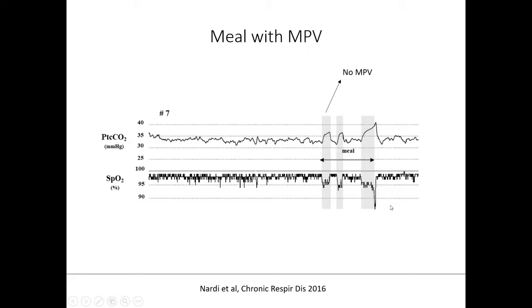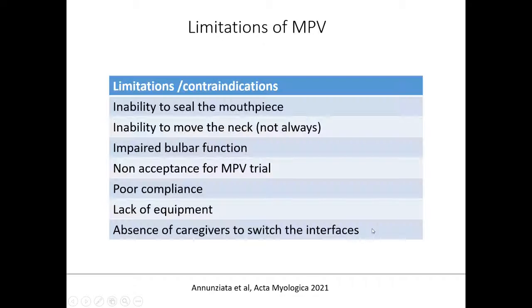It is up to the patients not to have too long a period without ventilation when they eat. So what we advise patients is to use the mouthpiece during meals and to have regular ventilation, for instance every minute or every 30 seconds, because when they stay too long without ventilation, they can have a rising CO2 and also some oxygen desaturation.